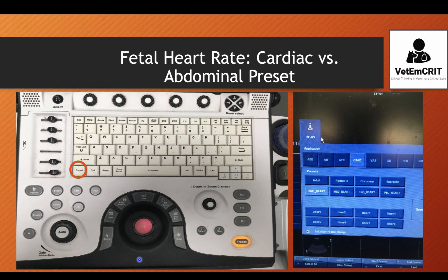In general, there are two ways to get the fetal heart rate: in cardiac mode versus abdominal mode or preset, and I will teach you both. In order to choose a preset, you need to find the preset button on your machine. As you click on preset, you will have different options. I'm going to start with the cardiac preset and then move on to the abdominal preset.